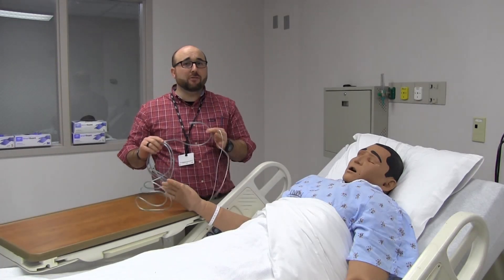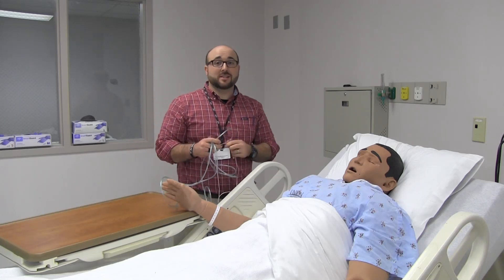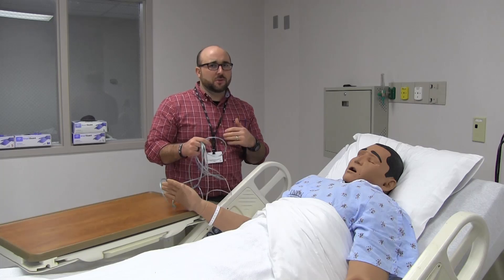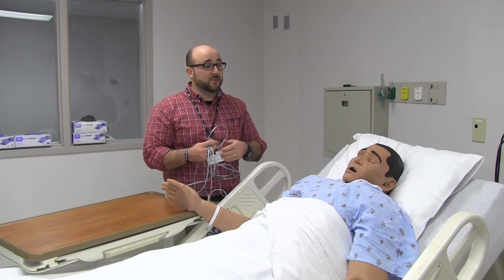We'll start with the first low-flow oxygen device, which is a nasal cannula. A standard nasal cannula can deliver 1 to 6 liters of oxygen. We'll talk about what that converts to in terms of the amount of oxygen they're actually inspiring, or their fraction-inspired oxygen, or FiO2.